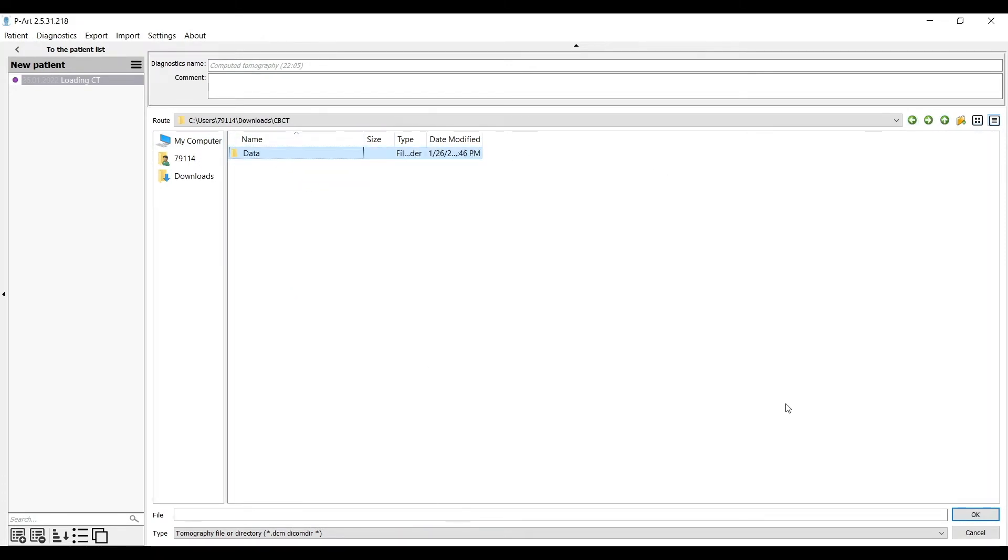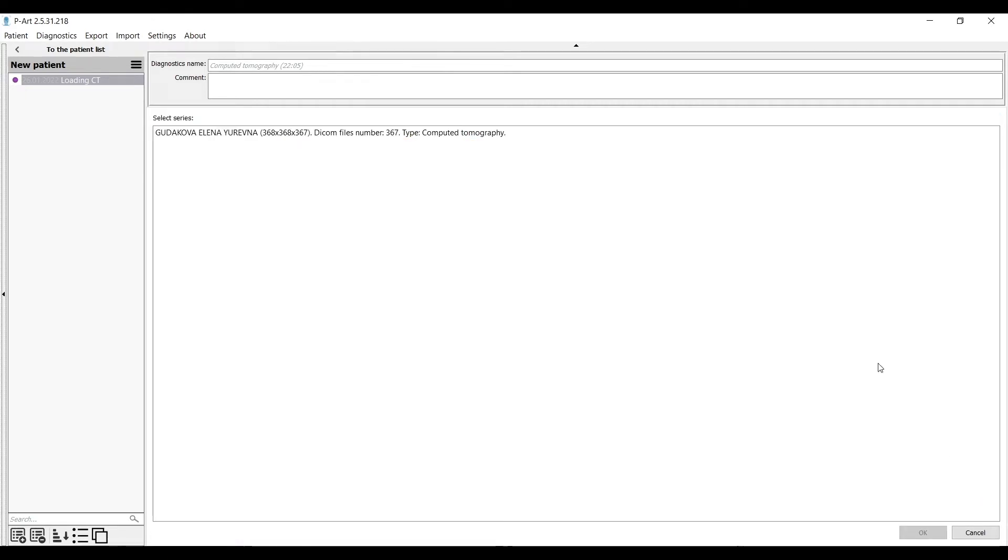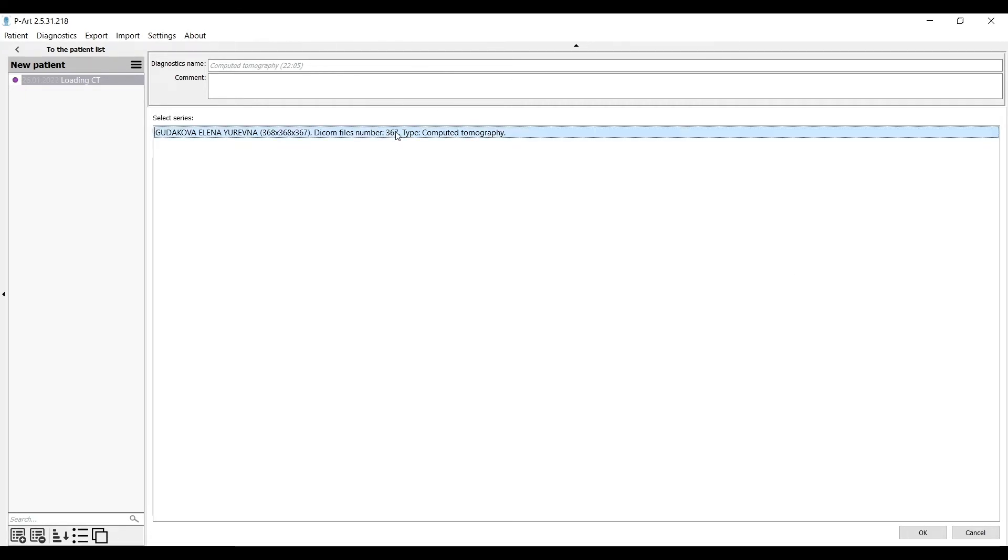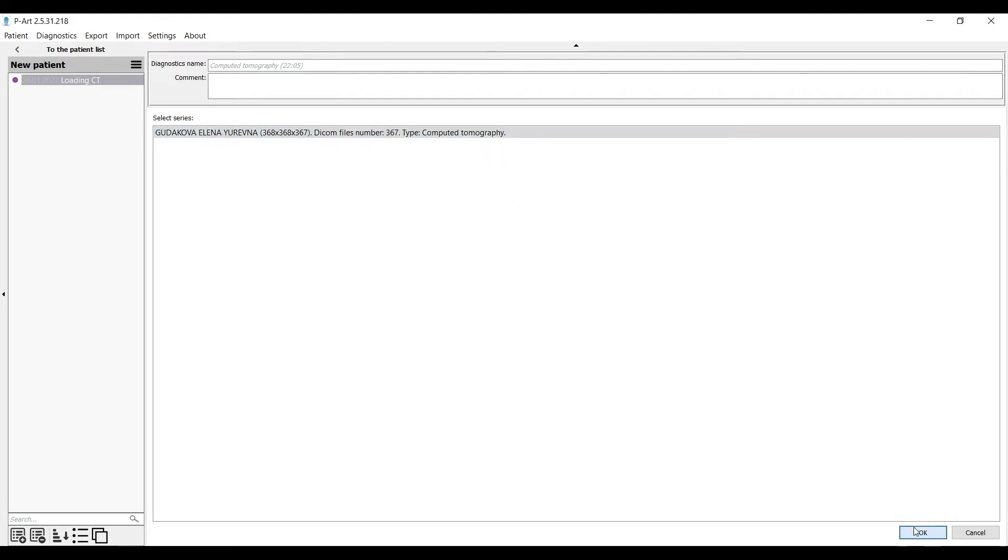If we have multi-file, we need to choose the entire folder with files. Then the program will give you the choice of files. You choose the biggest one, or the only one like we have.